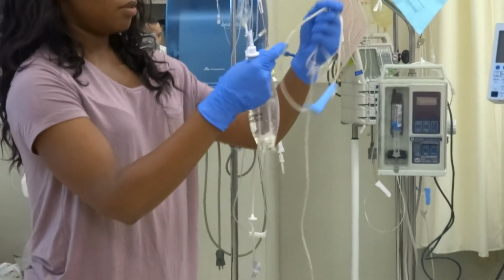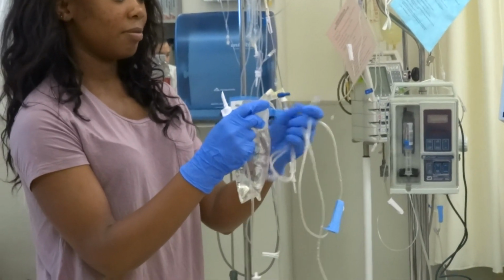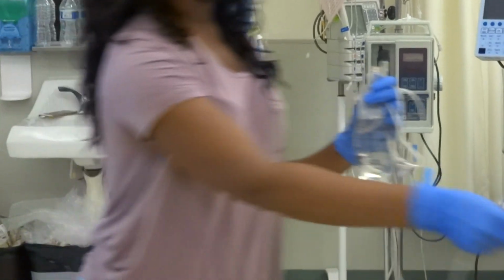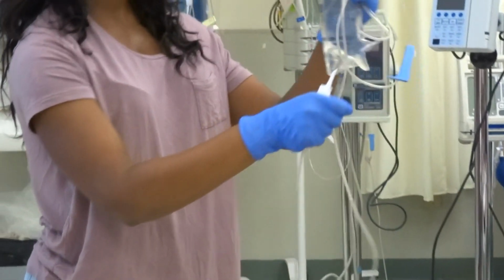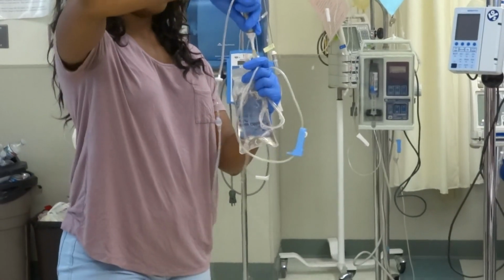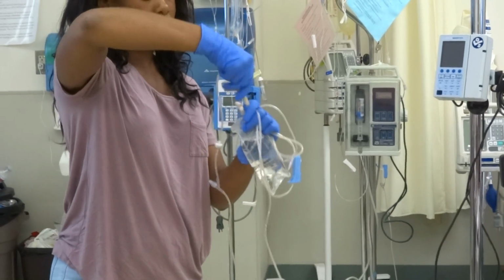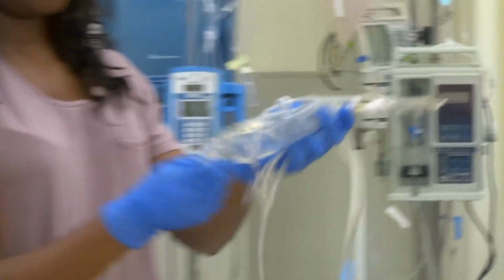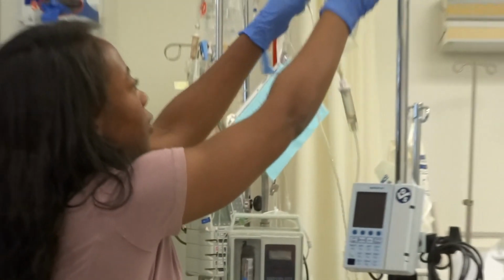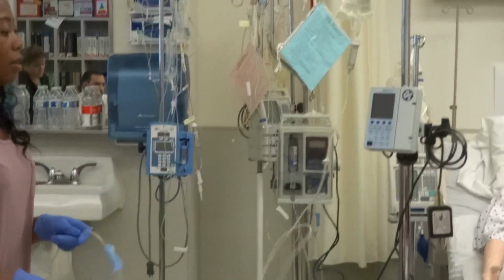It's always awkward at first, holding it, but you can do it like this, making sure that nothing touches. Go ahead and lift that off, and take this off second. That's how I like to do it. This first, that second. Put it just like this. Push and twist. Things are coming out. Hang it. Go ahead and straighten out your line.